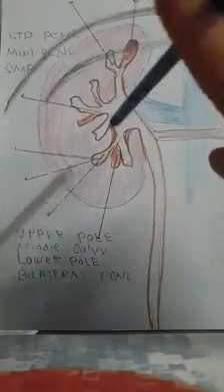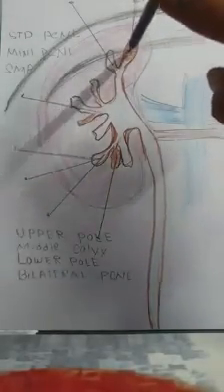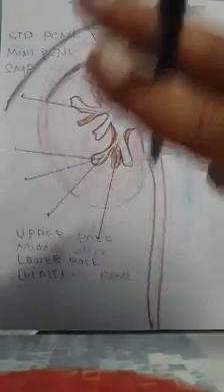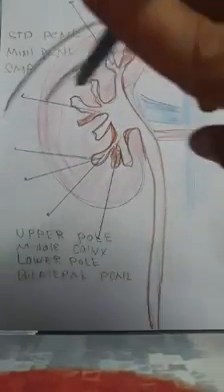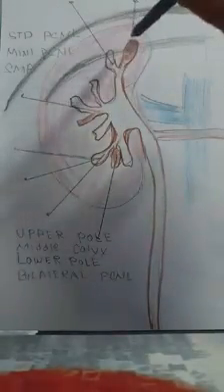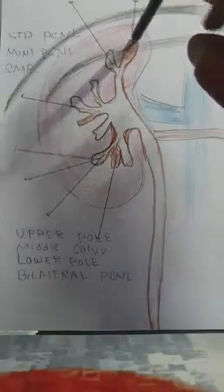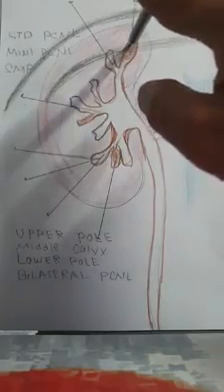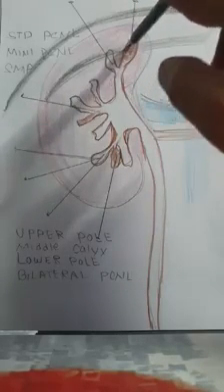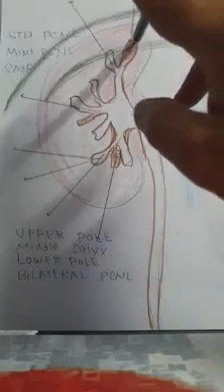I grasp the needle, my puncture needle, with my needle holder, so that I will not expose my hands to the radiation. By doing it this way, I put my puncture just exactly where there is a little bit of air which I injected here. Just 5 cc here, I can see it there, and it's very straightforward.